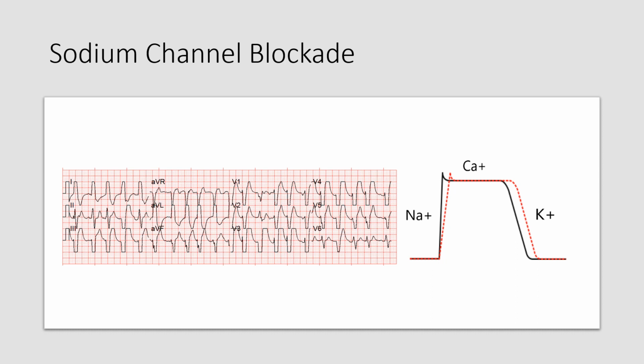But some drugs will cause cardiotoxic sodium channel blockade first, and some of them are not drugs you would expect. The ECG you see up there is actually a diphenhydramine overdose. The patient took around 7.5 grams. And so although Benadryl is primarily an antihistamine, it has a bunch of other side effects. Two very unfortunate ones are that it's a potent anticholinergic, and then at severe levels it has sodium channel blocking effects, and that's what you're seeing there.